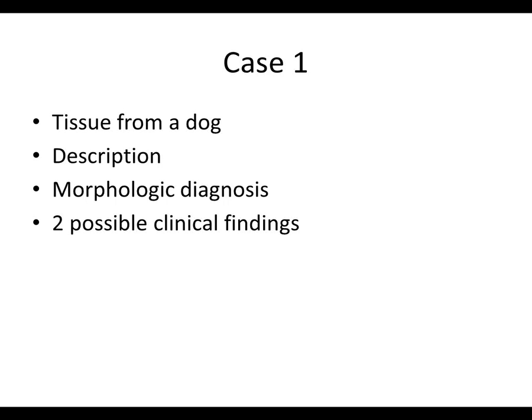George, you have downloaded the Dropbox images. Yes, the images from Dropbox. If you could pull up the first case, and we'll see if Becca can do a basic description. Well, if that's the case, then we'll have to have me be the presenter.